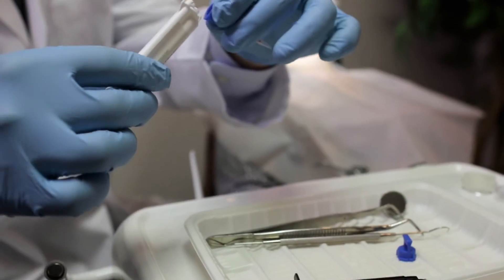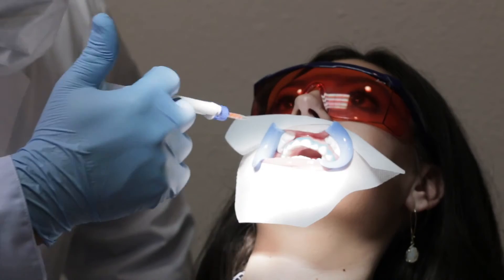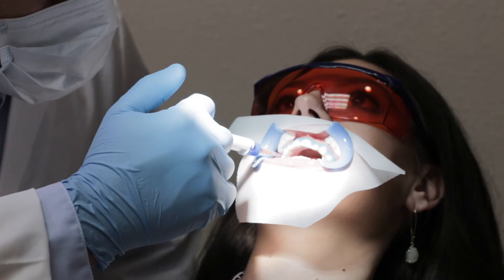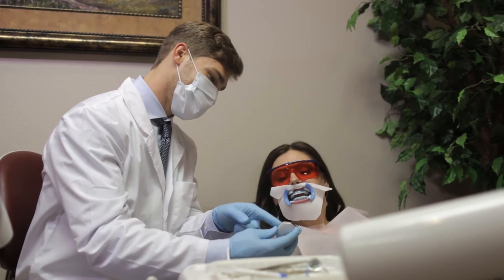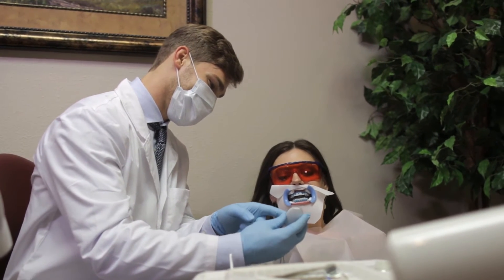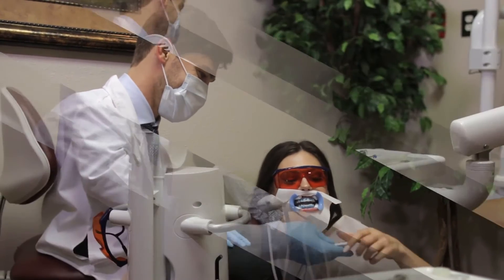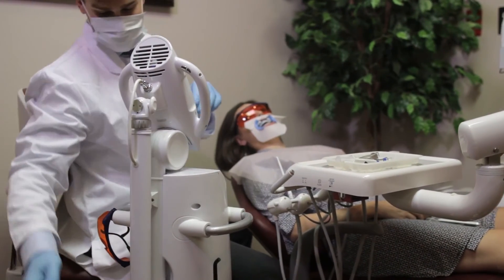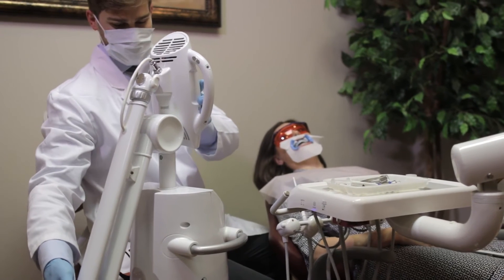Apply a 2 to 3 millimeter layer of Beyond 2 Advanced Formula whitening gel to the dry surface of the teeth. Give the patient the remote control and instruct the patient that the remote control has a pause/resume button to control the light if he or she needs to stop the treatment at any time. A call button is also included in case the dentist needs to leave the room during the treatment.